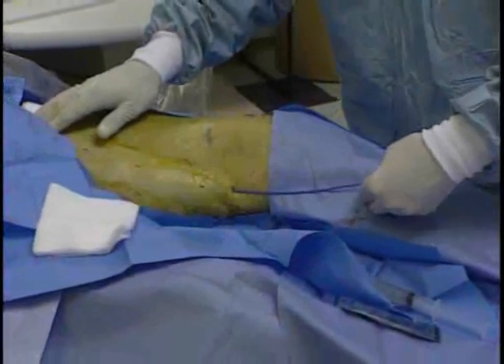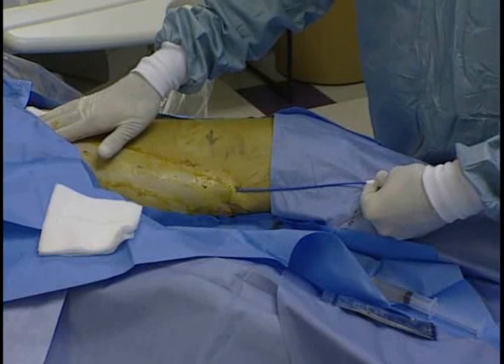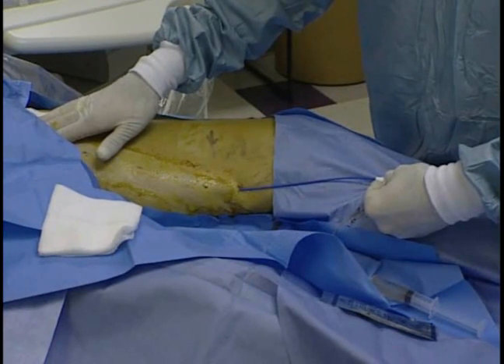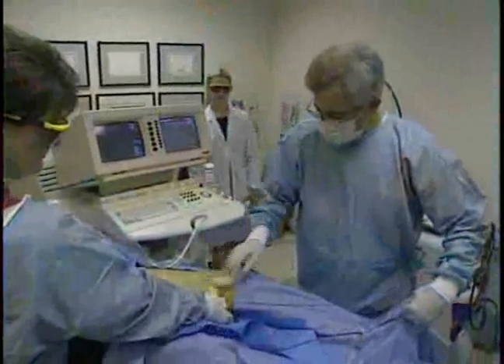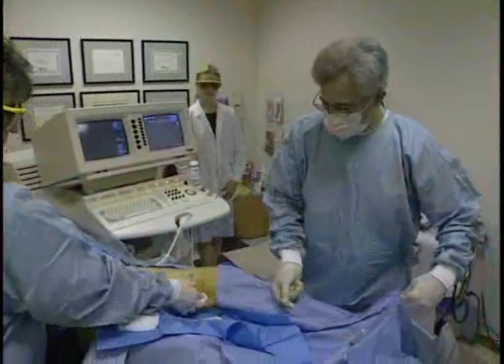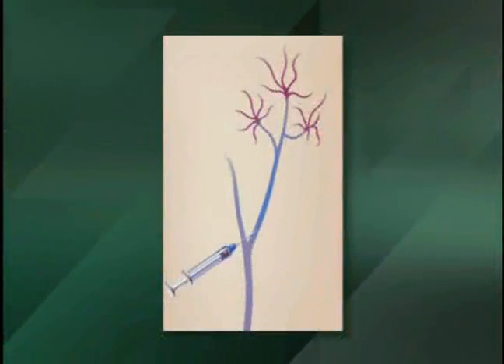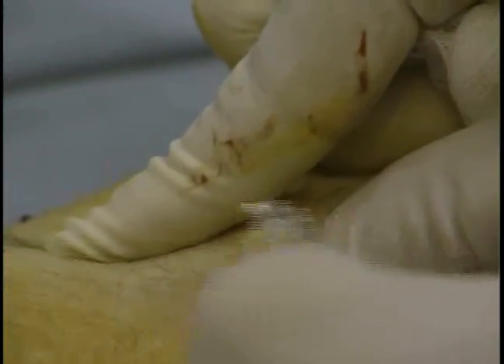Laser energy is delivered continuously as the laser fiber is withdrawn at about 2 millimeters per second from just below the SFJ to the point where the fiber enters the GSV distally. Once the distal segment of the vein has been treated, the laser is put in standby and the sheath and fiber are removed. Complementary treatments, such as sclerotherapy and ambulatory phlebectomy, may be done to tributary varices at the time of EVLT or at follow-up.